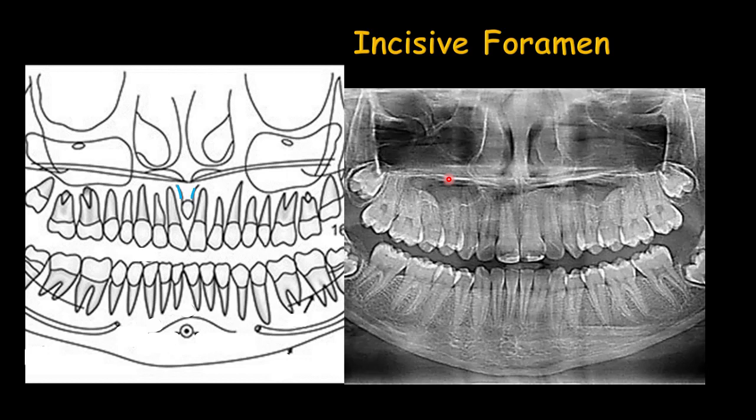The incisive foramen is beneath the anterior nasal spine, between the roots of the maxillary central incisors, and it has a round radiolucent shadow. You can see it in the panoramic radiograph — when you see a round radiolucent shape beneath the anterior nasal spine between the roots of the central incisors, you can identify it as the normal anatomical landmark called the incisive foramen.